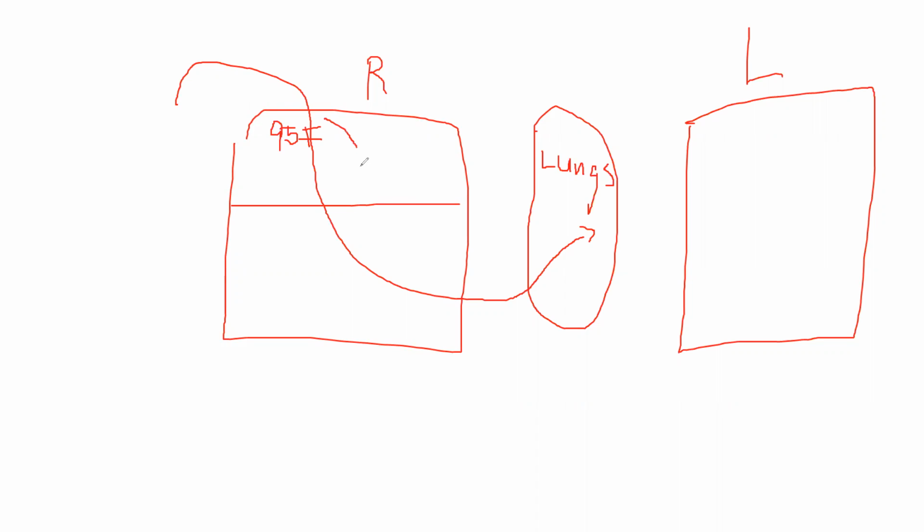We measure its distance right over here, or the speed in which this fluid goes all the way over into this area. And the speed in which this particular fluid that you gave travels is going to reflect the cardiac output. What do I mean by that?